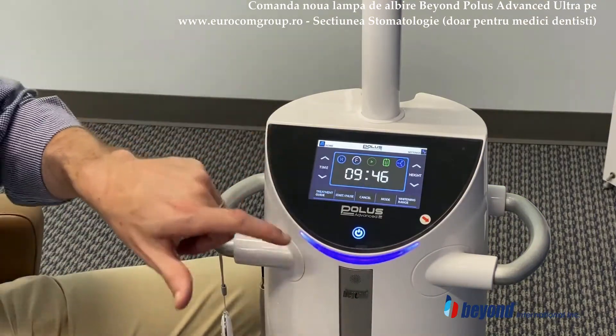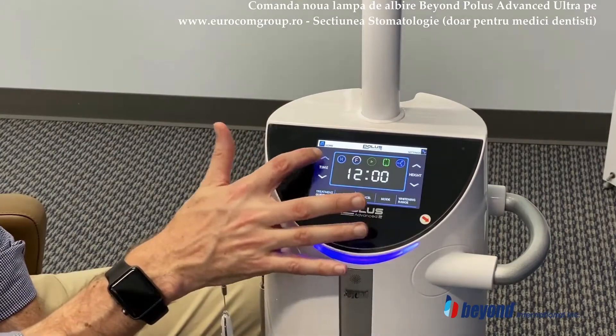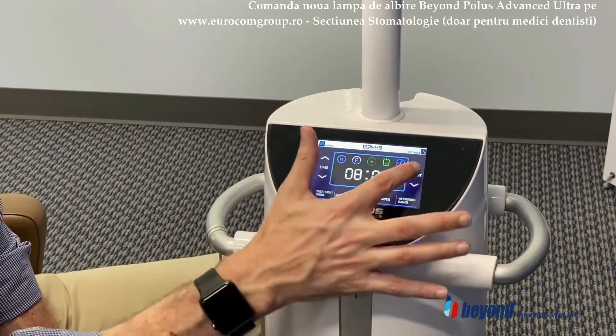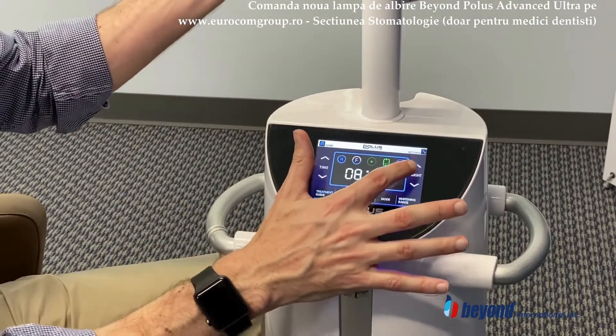This will allow you to make variations on your time that you want to use. So if you want to increase your treatment time, you can bring it up or bring it down. And of course, this is the height function, which allows you to bring the unit head above and below.